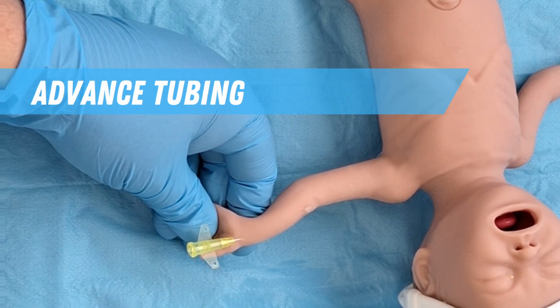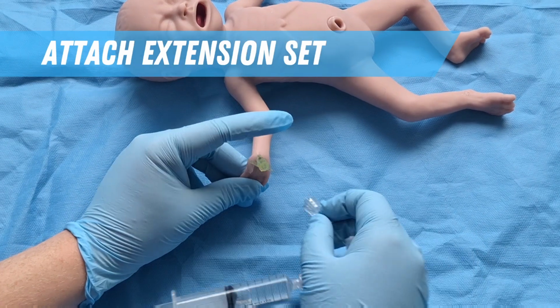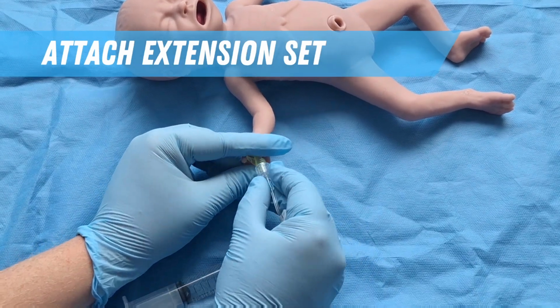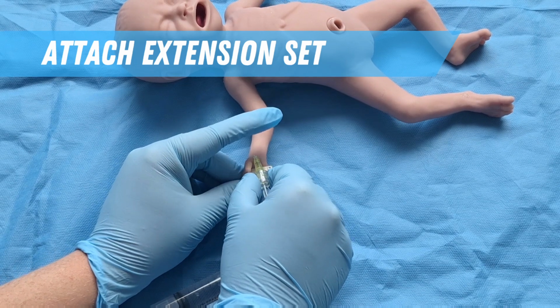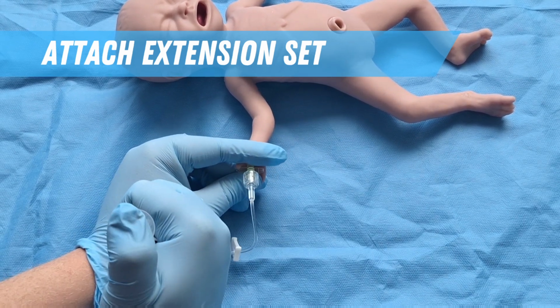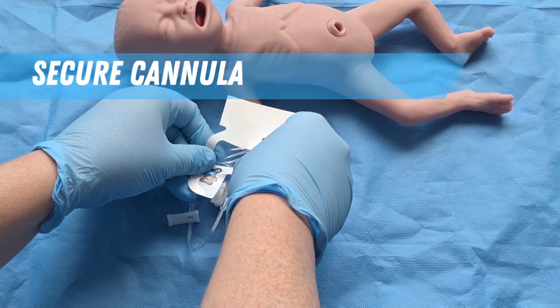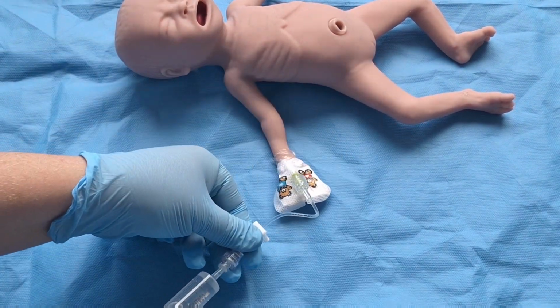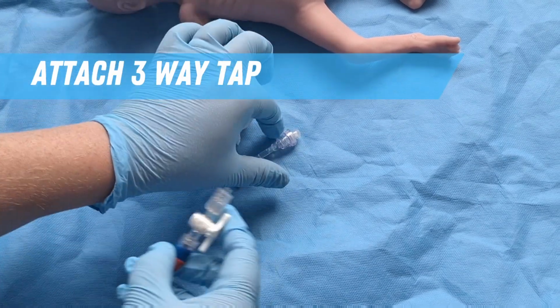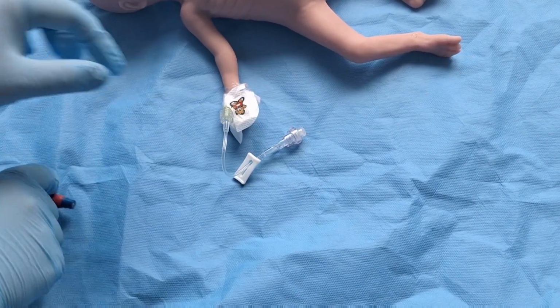Pulsatile bleeding from the cannula will occur if successful. Quickly attach the extension set and slowly flush with saline. It should flush easily, but if done too quickly, it can cause blanching of the hand, which should be avoided. Secure the cannula with steri-strips and a dressing and flush again. Attach the flushed 3-way tap to the extension set and attach this to a transducer.